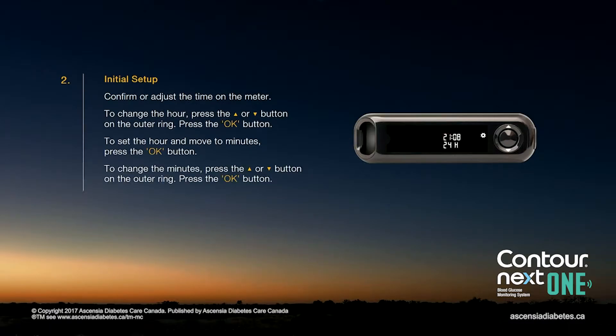Confirm or adjust the time on the meter. To change the hour, press the up or down arrow button on the outer ring. To set the hour and move to minutes, press the OK button. To change the minutes, press the up or down arrow button on the outer ring, then press the OK button.